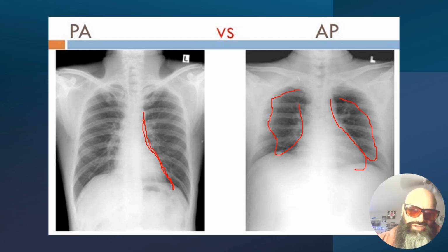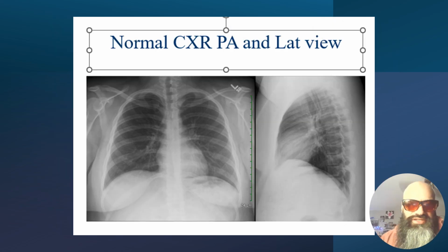So we do have to, in some situations of medicine, work with what we got. And if there's a patient who is completely bedridden or unable to walk for any type of reason, we're going to have to just manage with the AP view in this type of setting.